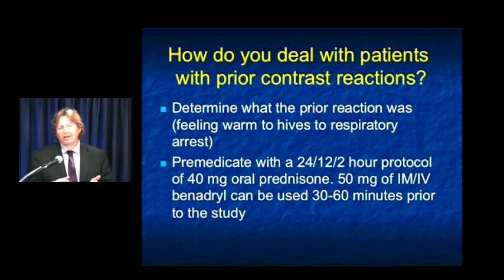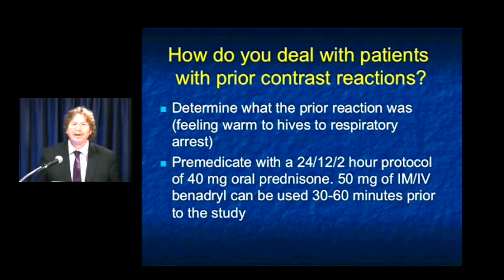Now, the other thing is if someone said to me, well, all I remember is I arrested and there was a team and I was in the hospital for 2 weeks. Well, I will tell you, if the patient had a severe reaction to contrast, I will not be giving IV contrast material to that patient. Now, in patients with reactions that are in between, some hives, things like that, then we pre-medicate.